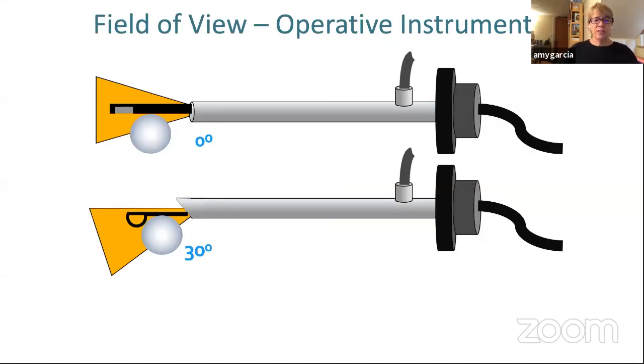When we bring an operative instrument into our visual field, we just need to be mindful of the differences of our view. So the tissue removal devices are using 0-degree lenses. And the reason they do that is because those long instruments are entering the hysteroscope from the back of the camera. So those are generally proprietary offset lens hysteroscopes. So the lens is set off at an angle to allow the instrument to come through the back.